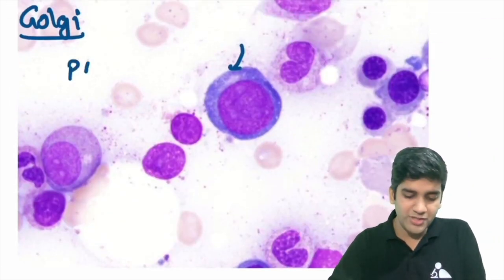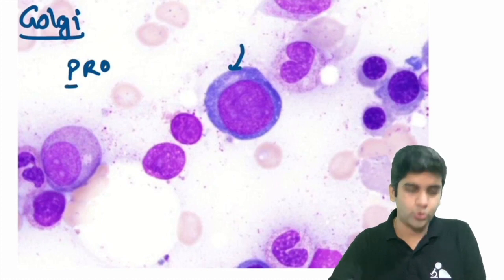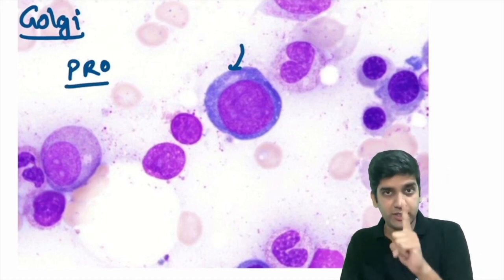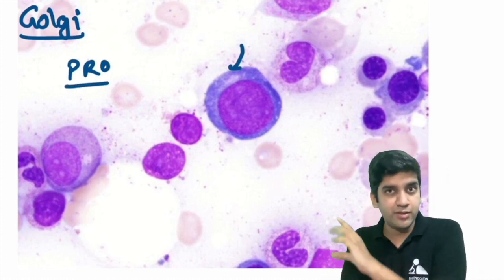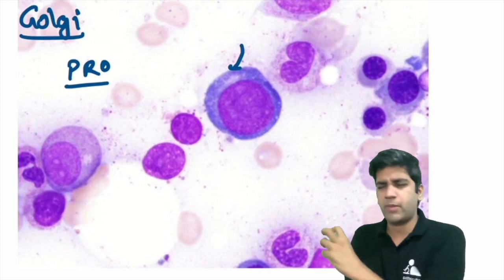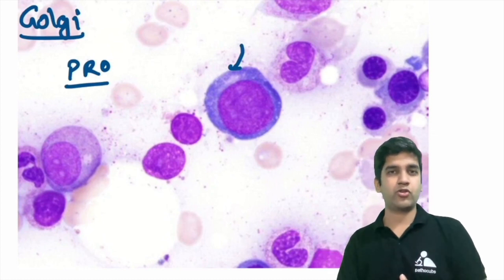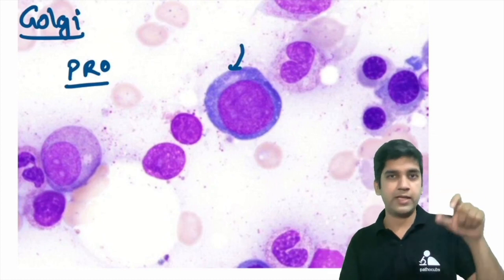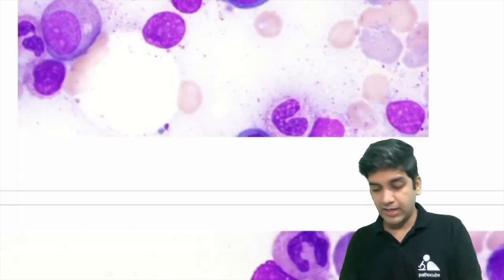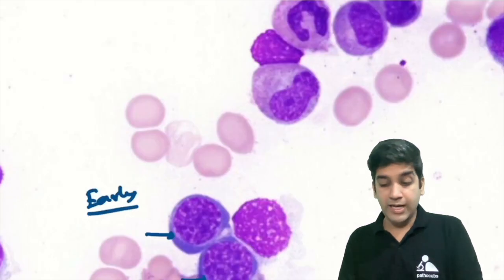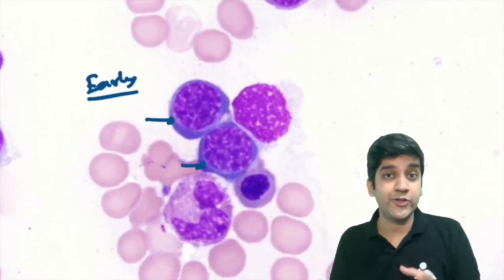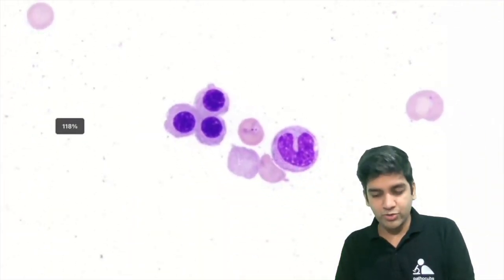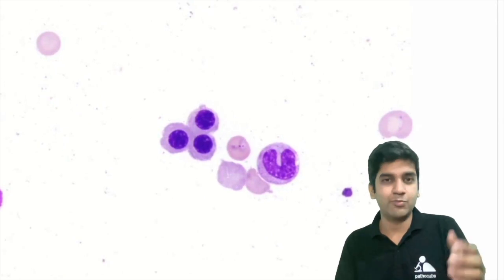Now compare: this one I call a pro-erythroblast or pro-normoblast. The nucleus is more important here — I do have a nucleoli, maybe not superbly defined, but a pale area that's a nucleoli. And in the early normoblast I have lots of stipple areas. These are the distinguishing features between the two.